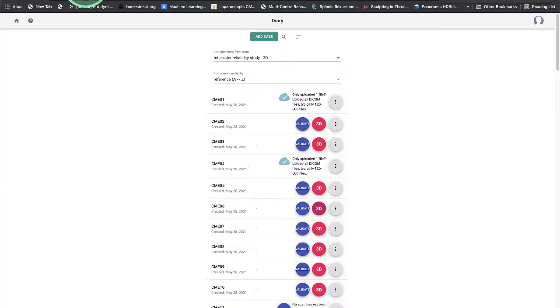The team at Innersight Labs have kindly offered to provide any technical support and are happy to run through the platform with you in person, but hopefully this video will provide you with enough detail just to kind of crack on with assessing the cases.